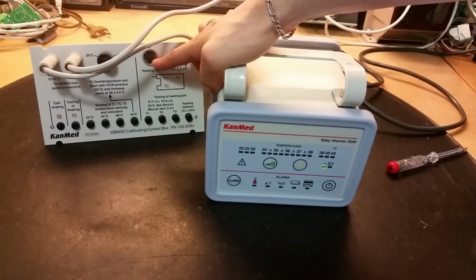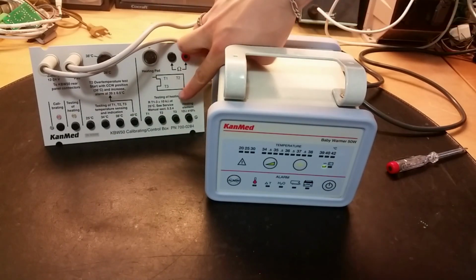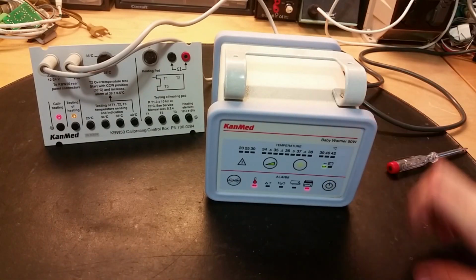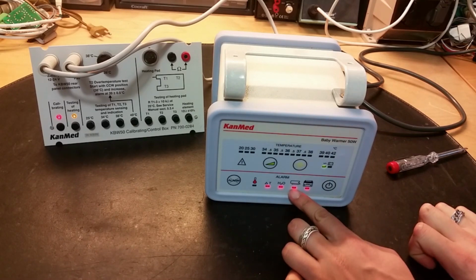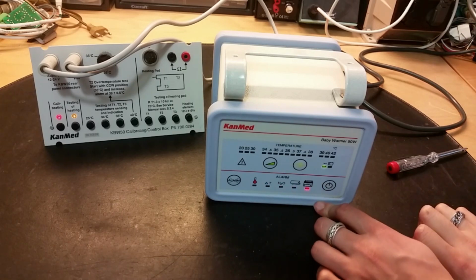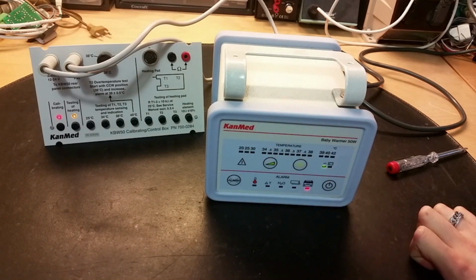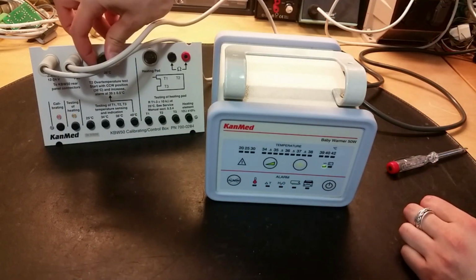I don't have the actual pad, I didn't find it in the dumpster, so that was a bit sad. Got a resistance ohm meter here if we want to measure the resistance of the heating pad. But if you turn it on, it just screams. And we don't got any heating pad, and we don't got any temperature differential, and water. You're supposed to have water there? I have no idea. So yes, degrees up here, how hot the heating pad actually is. So yes, that screams away. Sounds really bad.